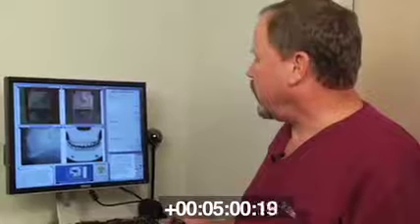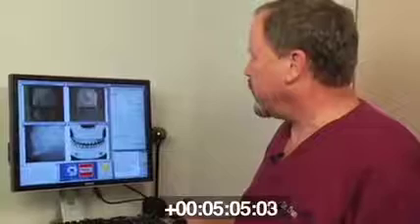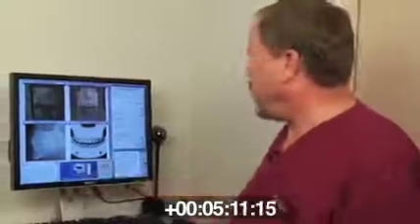And we'll do another quick scout image just to ensure that they're where we want them. And it should show this perfectly. That's a pretty good shot right there.